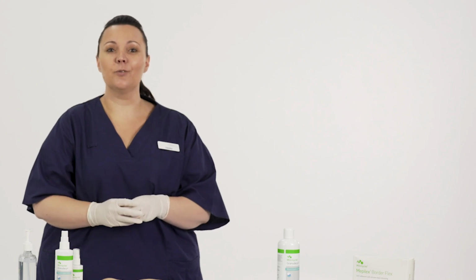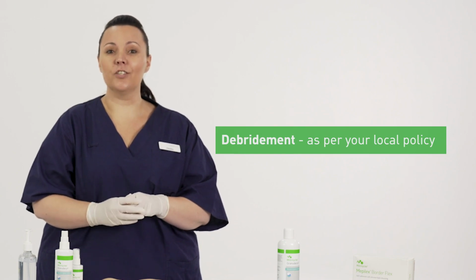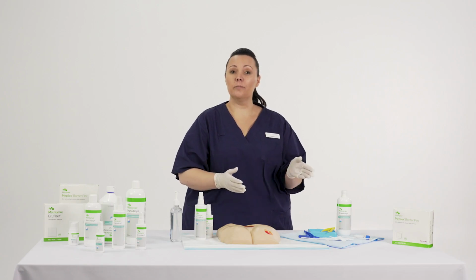The next tip is to ensure that debridement, when needed, is performed as per your local policy. Generally speaking, all clinicians are able to use mechanical debridement as an option. We will now demonstrate cleaning a wound using the gauze swab technique.